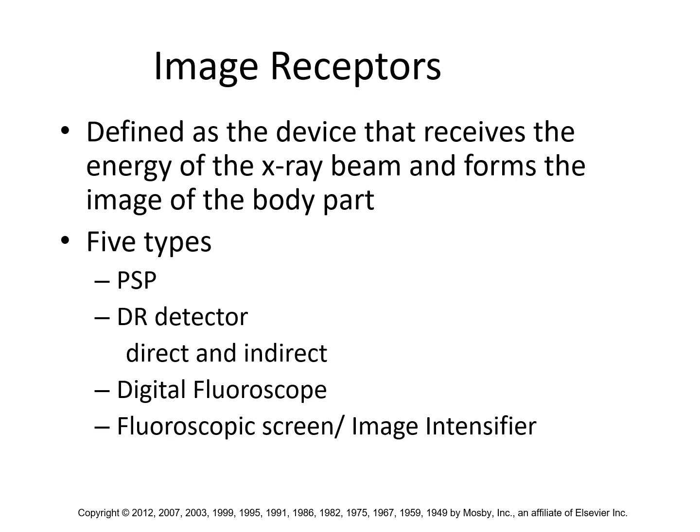Okay? The DR detector, the latest iteration of digital X-ray technology, stands for direct radiography. Both PSP and DR are considered digital radiography. Digital just means we're breaking up the big picture into an array or a matrix of very, very tiny picture elements called pixels.